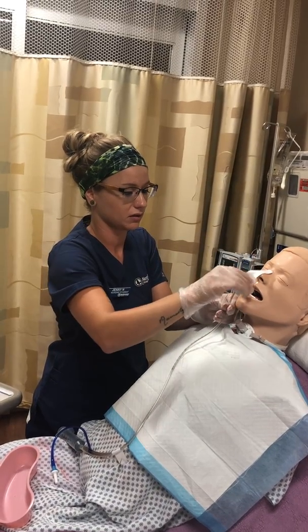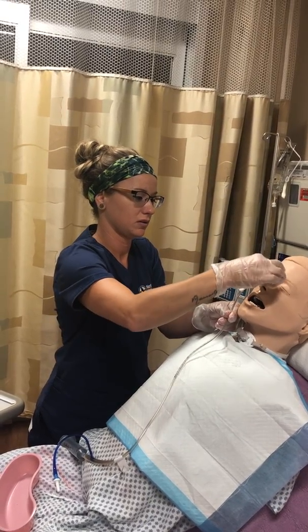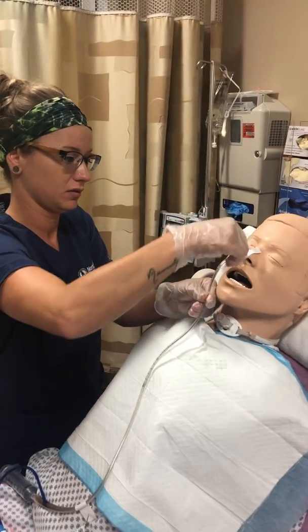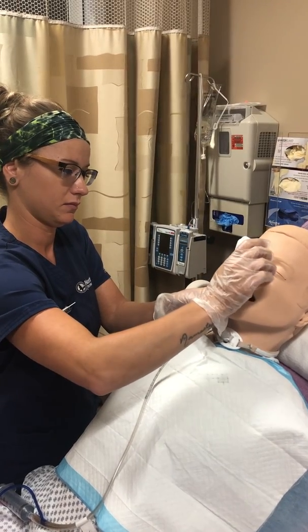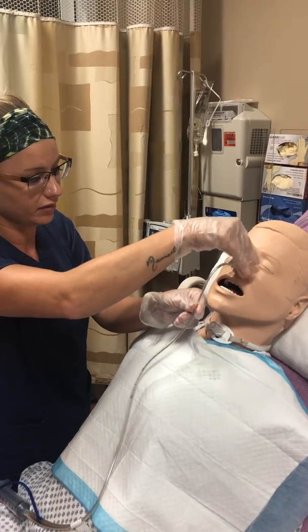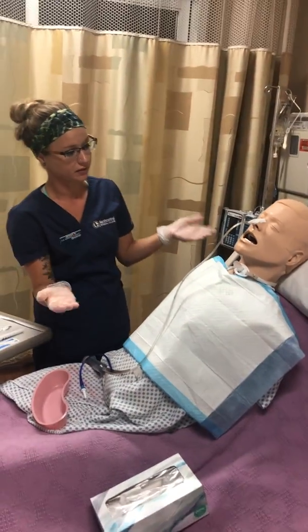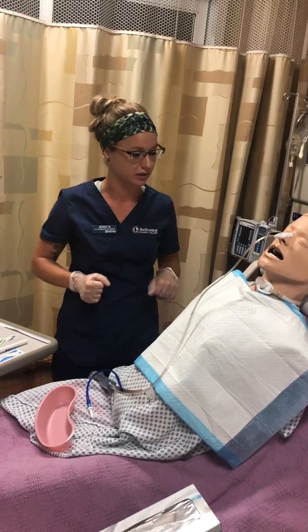It's also important to assess your patient, make sure that they're not experiencing any respiratory distress. So kind of loop around. Once you have that secured in place, you can let go of your tube, assess your patient, make sure she's doing okay, assess her respiratory status, make sure she's not having any difficulty breathing.